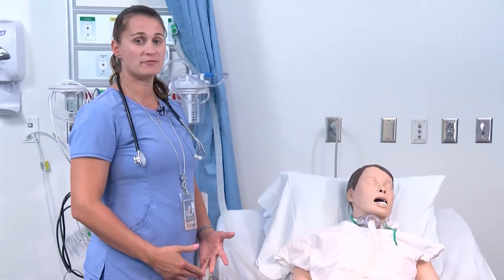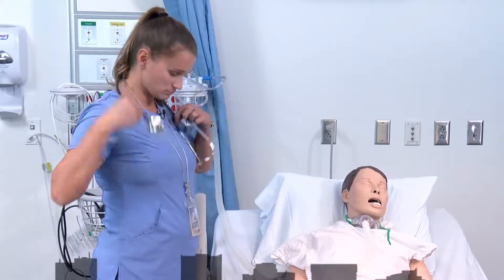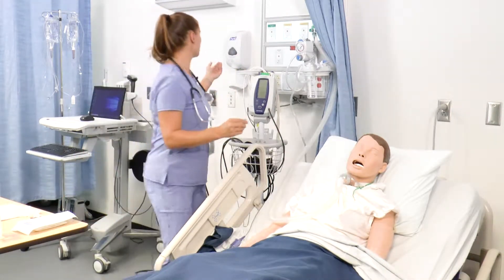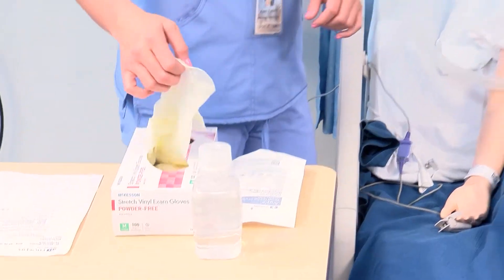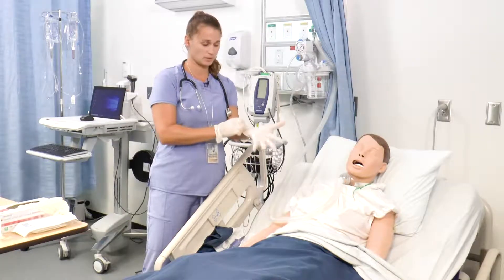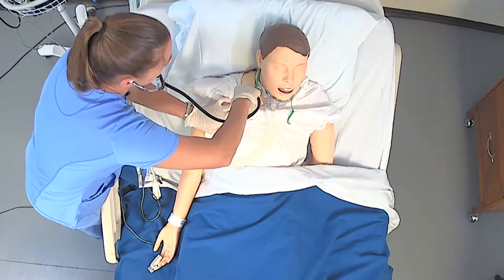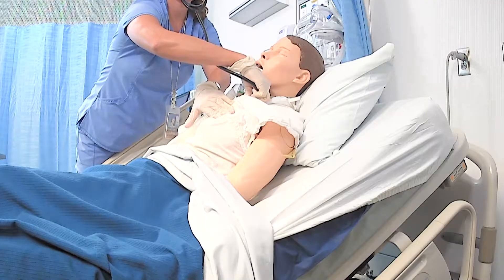I'm going to perform a physical assessment on my patient. Once I'm ready to do that, I need to wash off my stethoscope, then perform hand hygiene and put on gloves. I'm going to be listening to your lungs — I'll go underneath the patient's gown. Take a deep breath in and out. Take a deep breath in and out. Excellent.